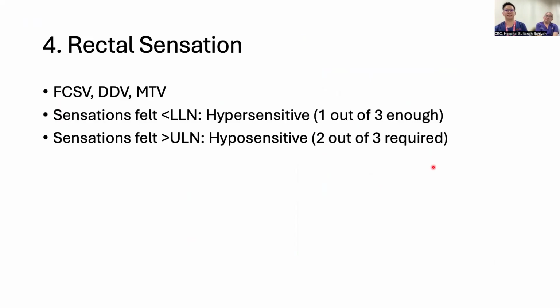And finally, we talk about rectal sensation, the 3 sensations. When do you first feel something that doesn't go away? When do you feel like going to the toilet but you're still comfortable, still can tahan, still don't want to go yet? Or when is it you cannot stand it, it is coming out, it's just a matter of time, you have to go to the toilet, maximum tolerated volume.